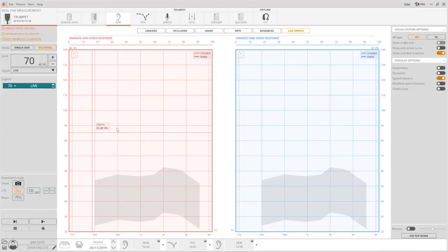This way, the HL SPL conversion of the pure tone audiometry does not depend on the selected fitting rule, but on a default conversion used for the speech mapping.